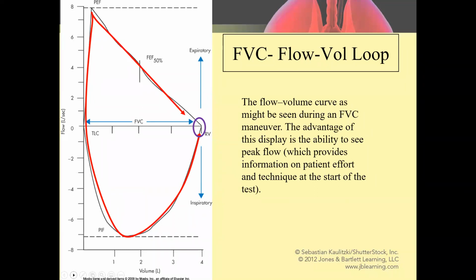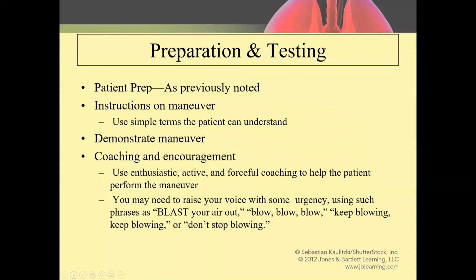So preparation and testing, again, patient prep, as previously noted earlier in the presentation: instruct on the maneuver, use as simple terms as possible, account for translation if that's necessary, demonstrate the maneuver. Of course, you're not going to put your lips on the mouthpiece, but there's ways that you can demonstrate it effectively. In some cases, you can show videos and things along those lines.